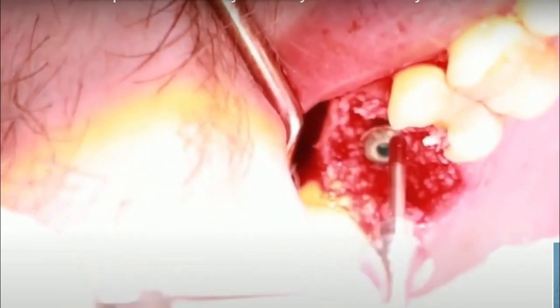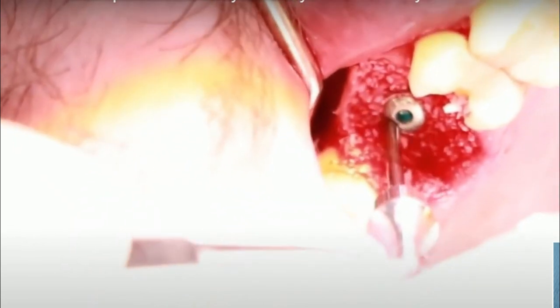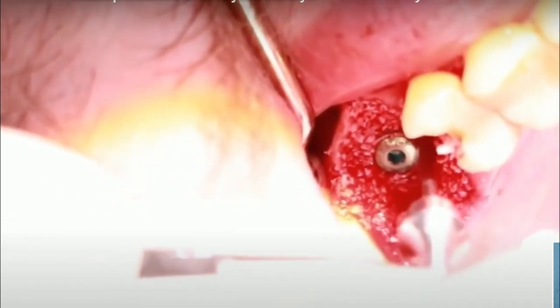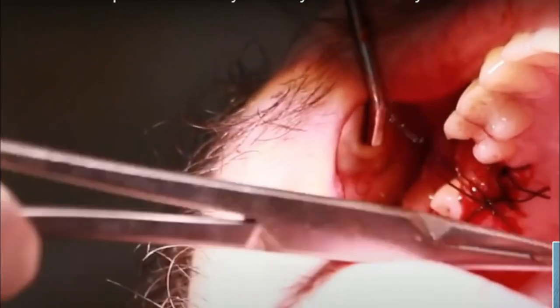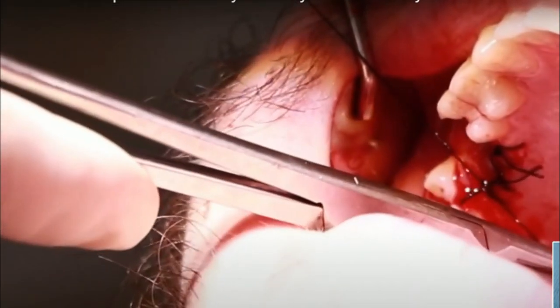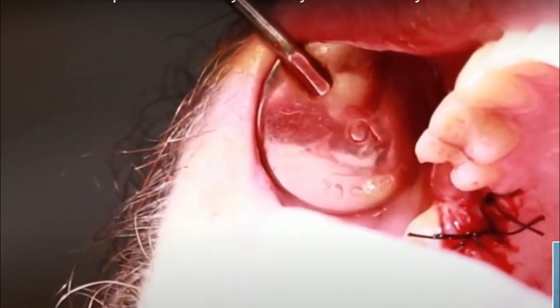This will be covered with a collagen membrane and on top of that a PRF membrane, and the entire buccal flap is sutured over it. After that, a separate procedure will be required for the keratinized tissue on the buccal side.